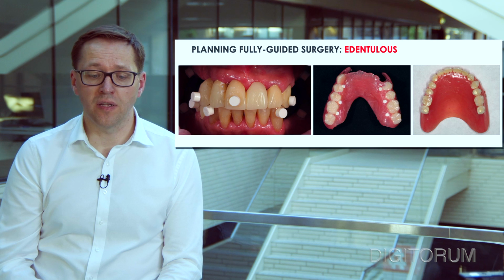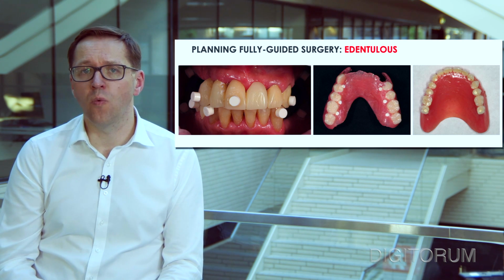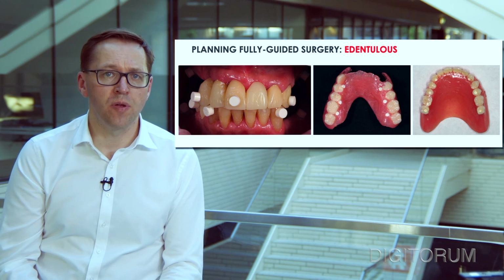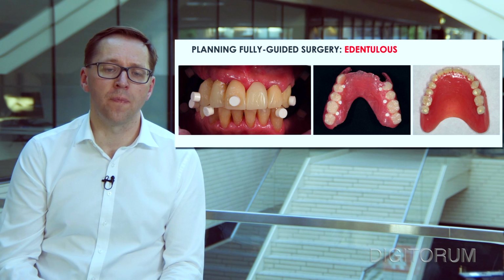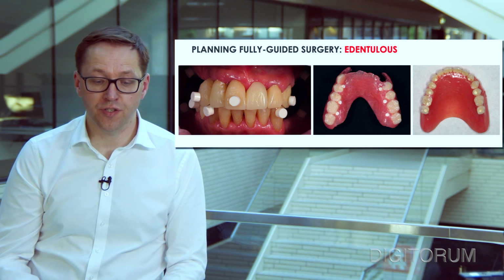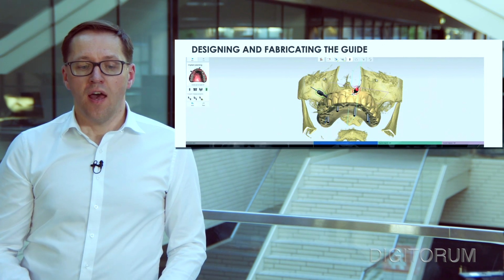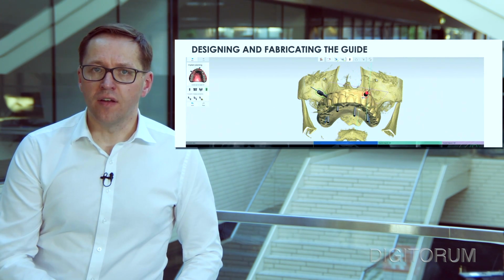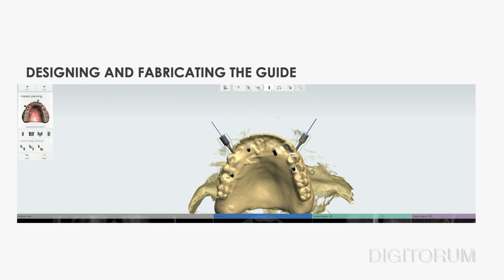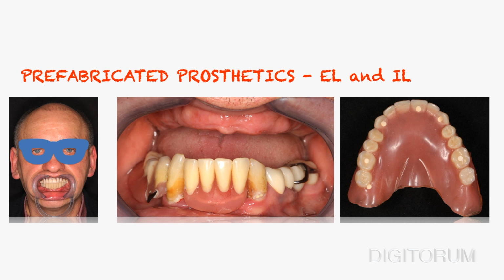We can also use these teeth as a support for the guide during the fully guided surgery. But in some cases, we can modify the protocol for how we do CBCT, because we need some reference points in order to superimpose, to align the CBCT and intraoral scans. Because in CBCT, for example, temporary restorations will not be visible. And the way you design the surgical guide, there are so many variations, so many types of them, but there are certain requirements that the guide must fulfill, but I will not go into the details too much here. And let's see the patient.